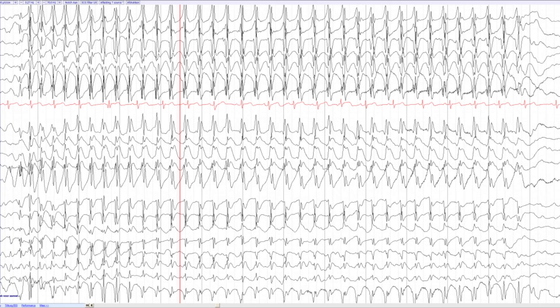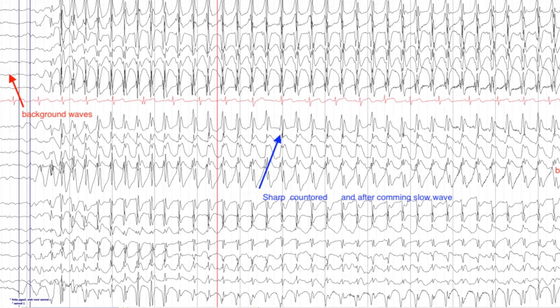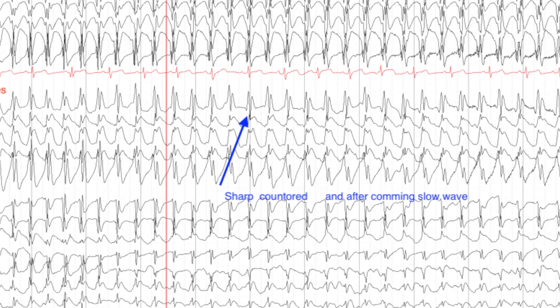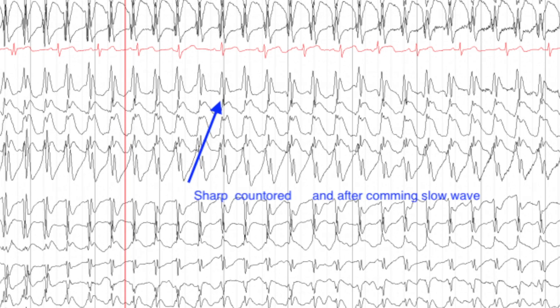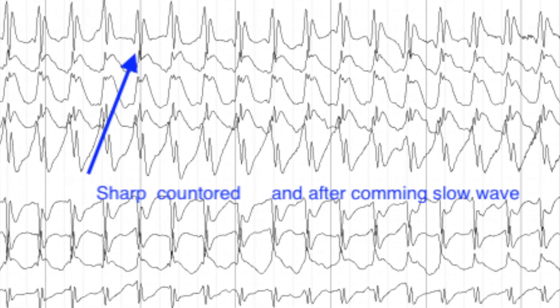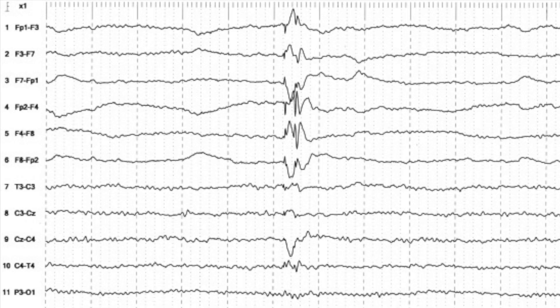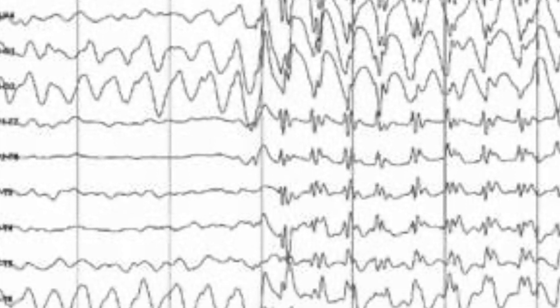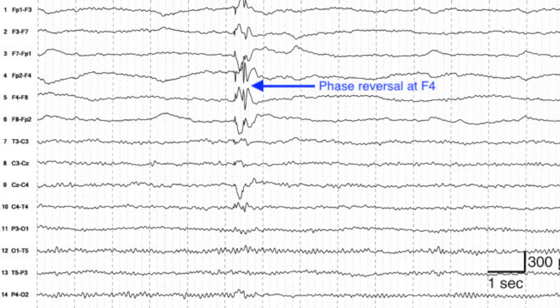Among any waves that disrupt the background, the most important are epileptiform discharges, so their understanding is very important. Epileptiform discharges are characterized by sharp contours with less than 200 millisecond duration. They have multiple phases, disrupt the background, are always followed by an after-coming slow wave, and should have a sensible electrical field. Epileptiform discharges could be focal or generalized.